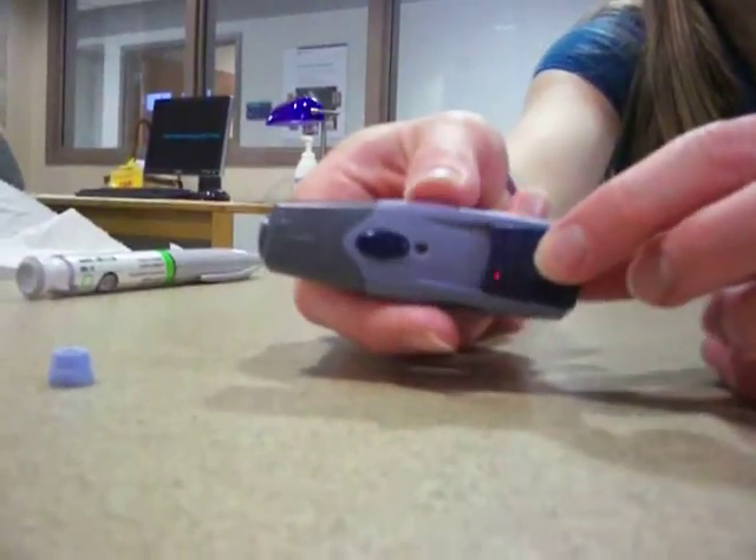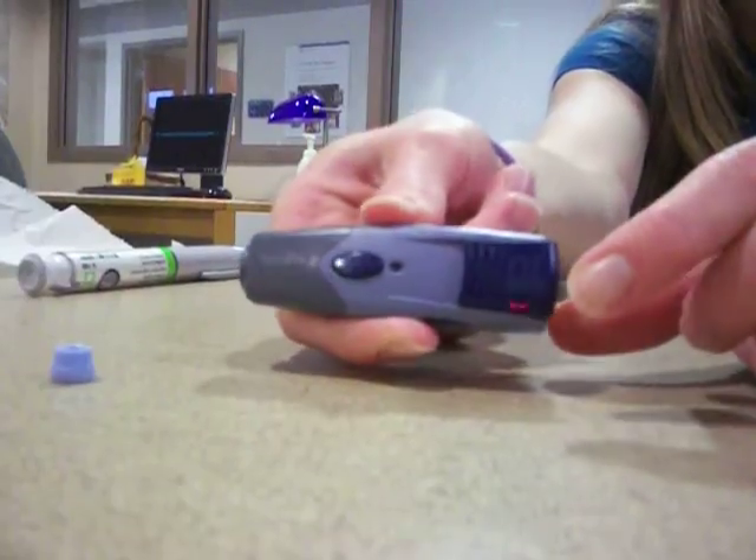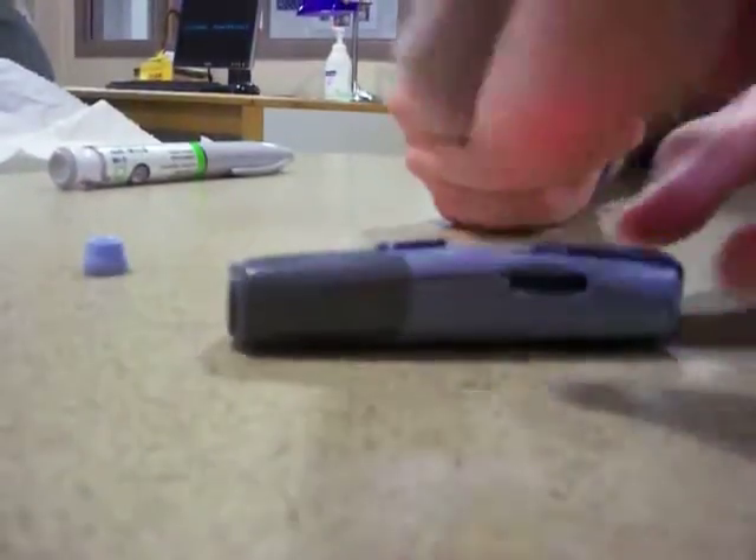Okay, so to reset it, pull this blue part back. It just re-cocks the spring. So then you can pull the finger.